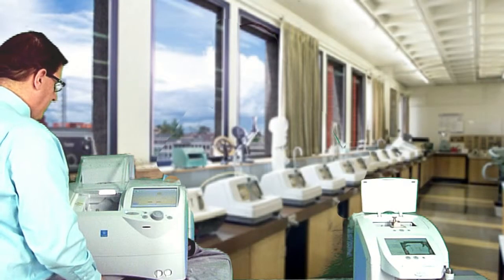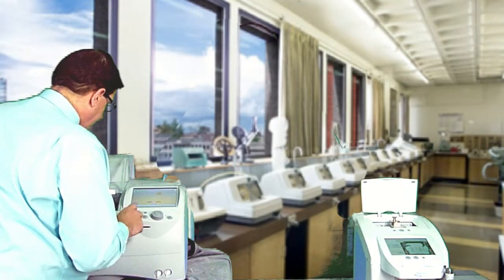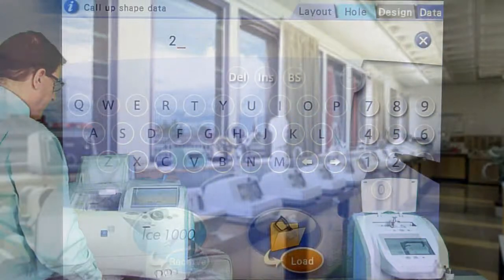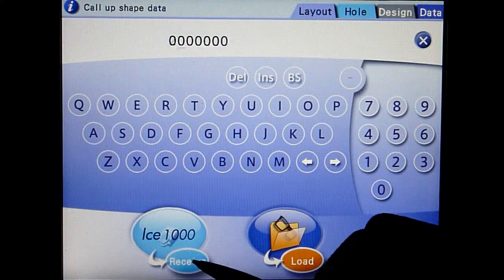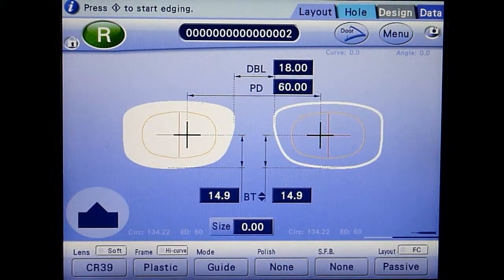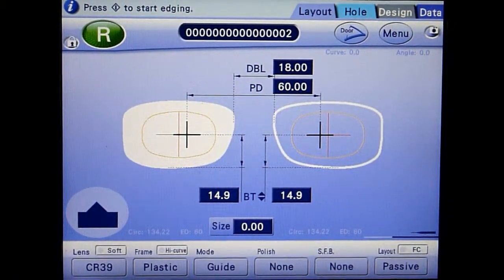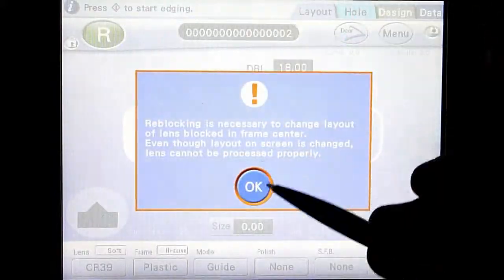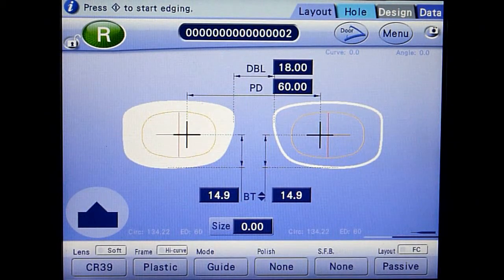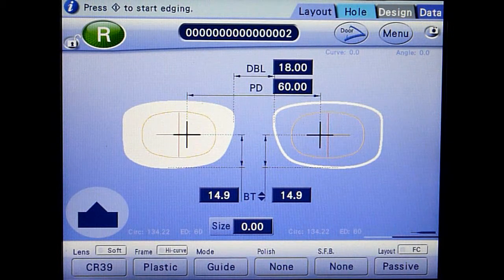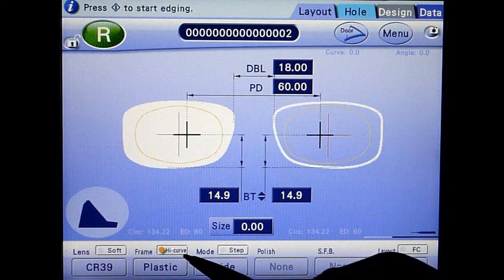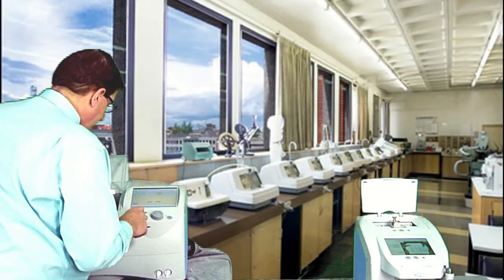Load a lens into the edger. Bring the shape up on the display. Touch the unlock button. Touch the high curve button. Start the edging process.